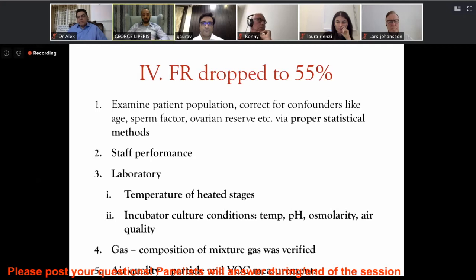Make sure that the filters are being routinely checked, and we avoid introduction of any cosmetics inside the laboratory, any paintings, any construction, anything happening around that can affect. Also, for infection control, of course, using good hygiene, and if we suspect that there could be some infection, then we can use settle plates and culture those in order to see whether we have any bacteria or fungi.